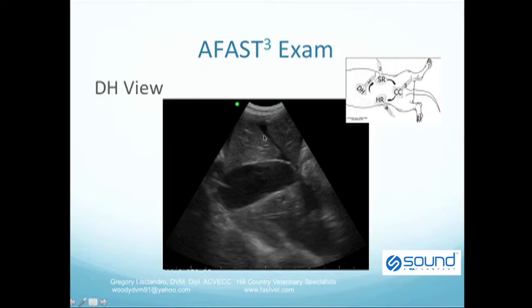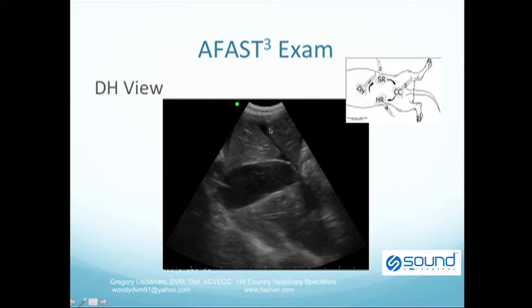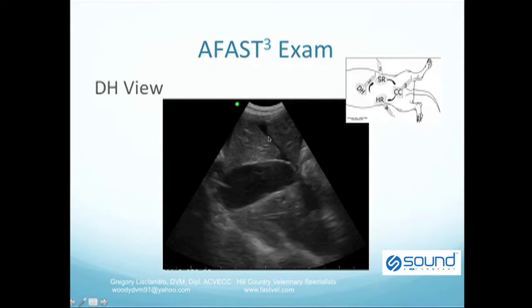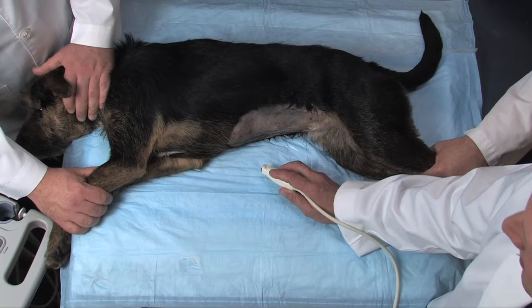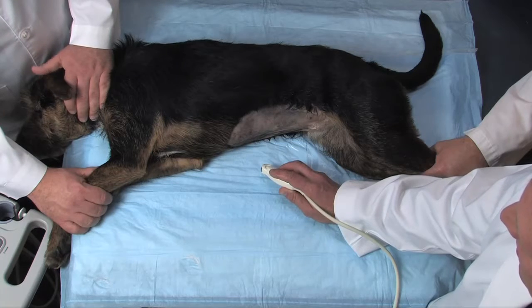This patient is positive, as you can see a liver lobe and these anechoic black triangles. Anechoic black triangles are the easily recognizable ultrasonographic findings in FAST exams for free fluid. Here we are at the DH view.